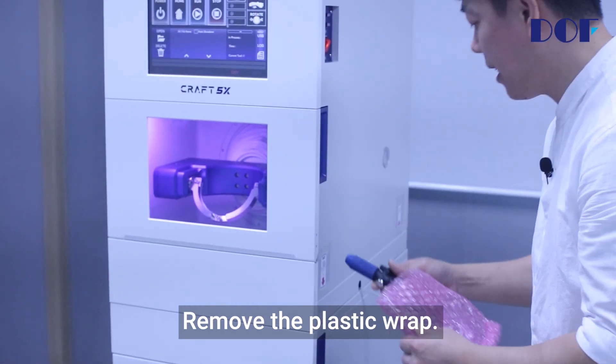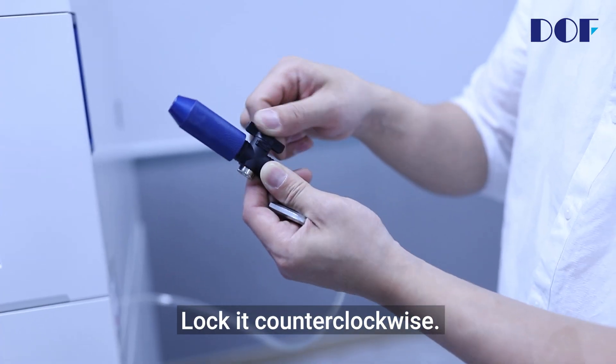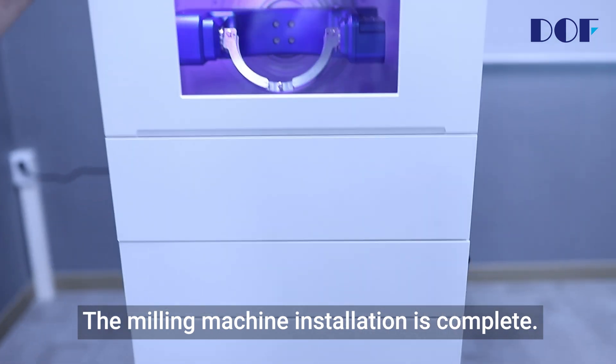Here's the water gun — remove the plastic wrap. Keep the water gun locked at all times; lock it counter-clockwise. Stick it on the side of the machine. The milling machine installation is complete.